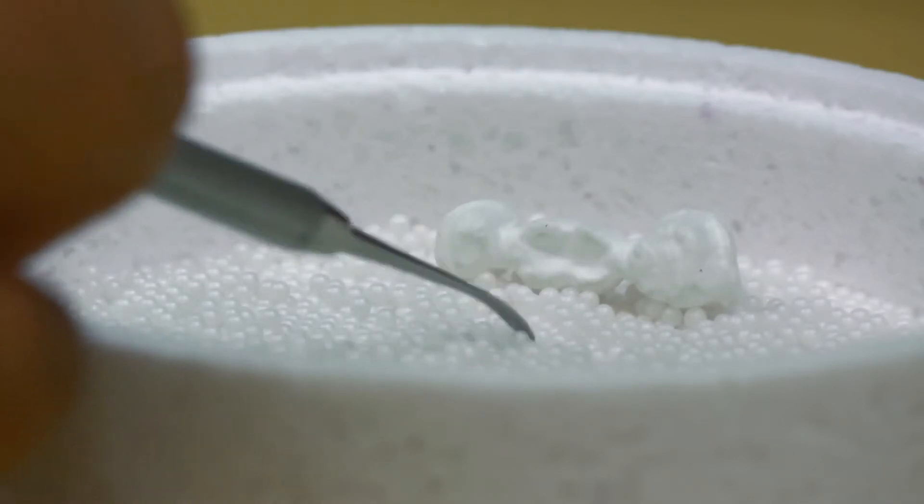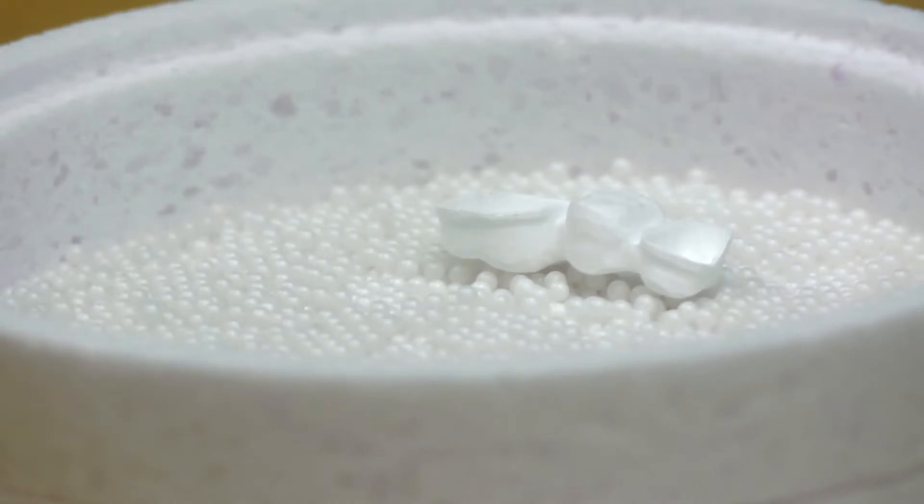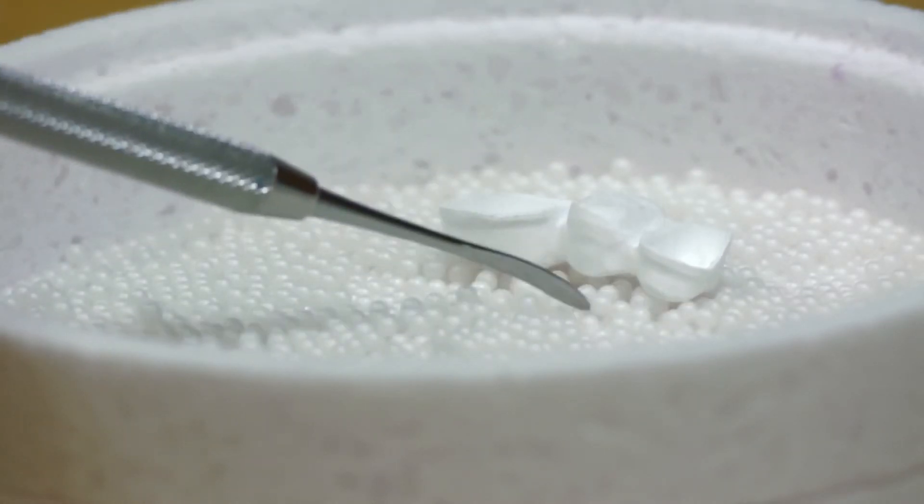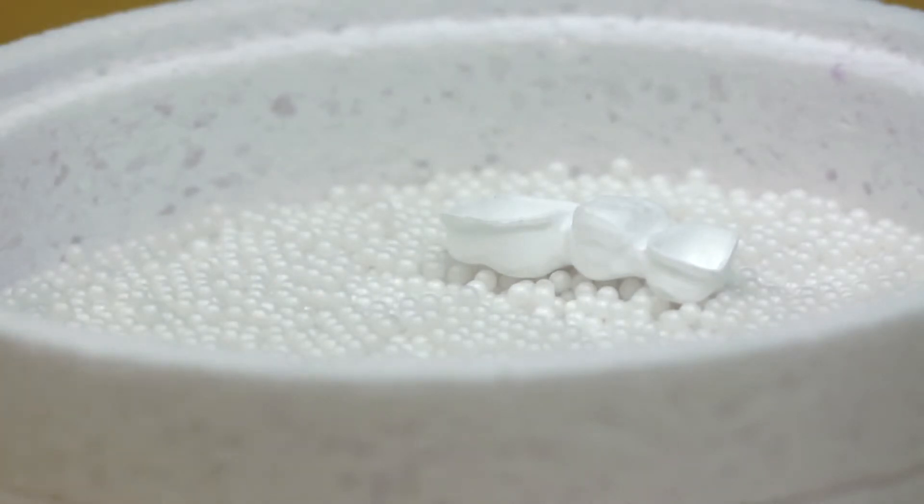Use additional sintering beads to support ends of the restoration which have hollow areas. Support every restoration pontic with at least one sintering bead so that the bridge restorations are adequately supported along the entire length of the restoration and do not lie hollow.